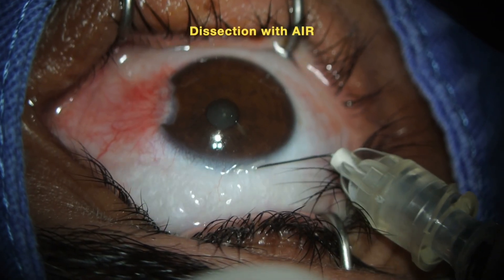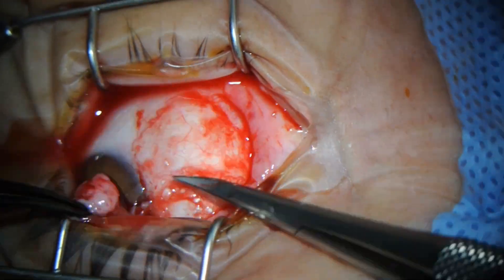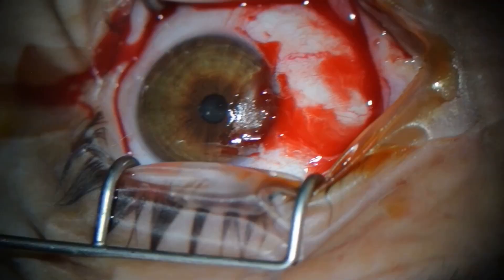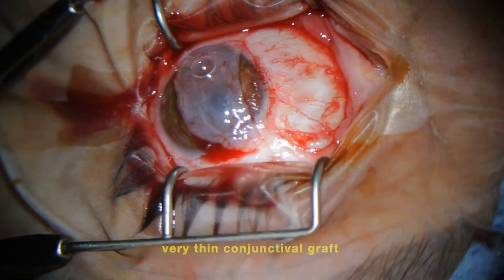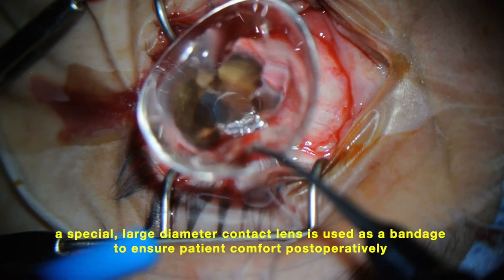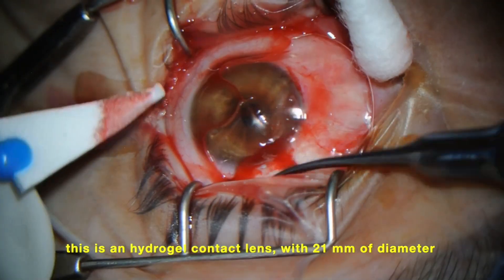Here we can see the dissection with air, and here the pterygium dissection, with only minimal use of cautery. It makes possible a very thin conjunctival graft. A special large-diameter contact lens is used as a bandage to ensure patient comfort post-operatively — a hydrogel contact lens with 21mm diameter.